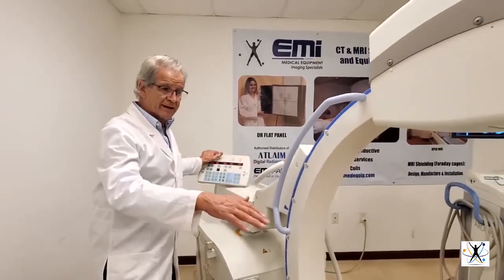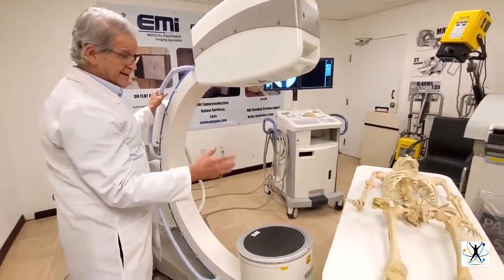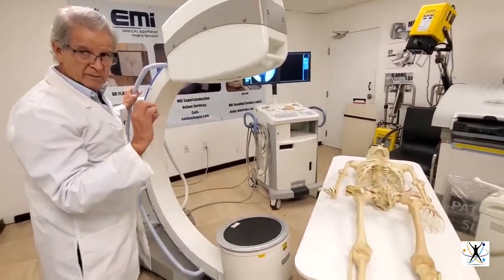You put a patient — like in this case, a very skinny patient — and the machine automatically goes to very low levels of radiation.